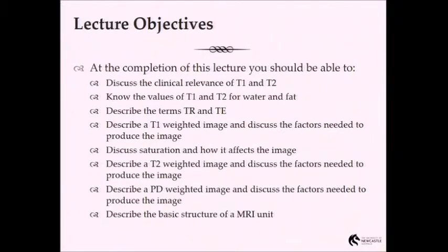So what we really do when we talk about T1 imaging is T1 weighted imaging. It's not looking at the full relaxation time; it's setting the parameters in the scanner so that we weight the contrast for that scan towards T1 values. We do that for T1, we do it for T2, and we do it sometimes for T2 star, particularly if we want to look at hemorrhages.